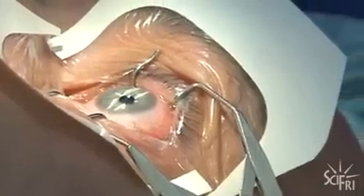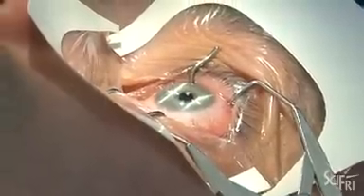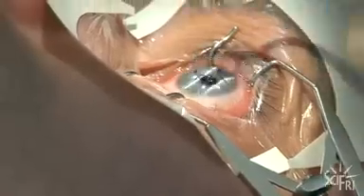There's hardly anything more uncomfortable than watching an eyeball, and beware, this is not for the squeamish, get poked, suctioned, sliced, zapped with a laser, and then sponged off. And yet each year millions of Americans pay for this treatment in the form of laser eye surgery.